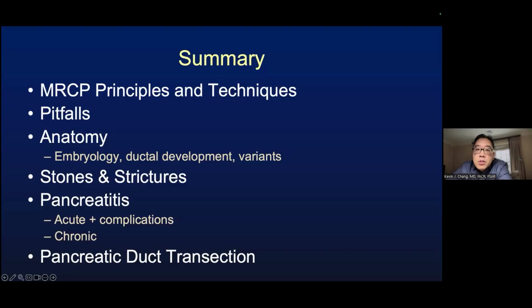Any tips for differentiating focal chronic pancreatitis on ADC and dual energy CT? Good questions. I'm not familiar with using ADC maps to evaluate chronic pancreatitis. We do have a lot of dual energy CT at my institution.